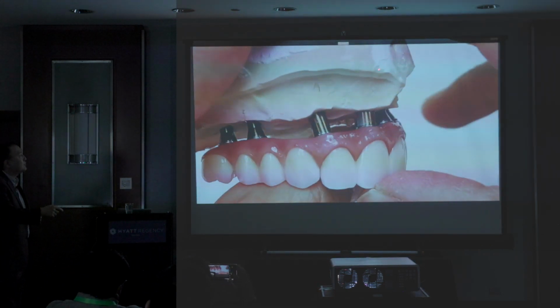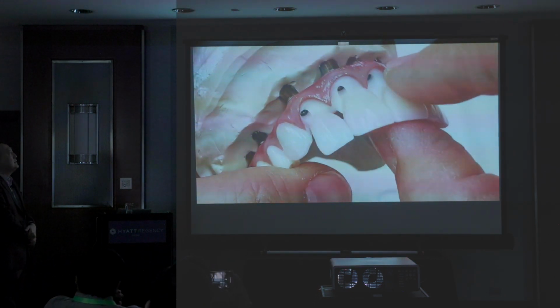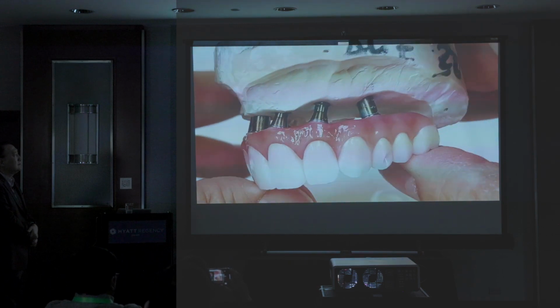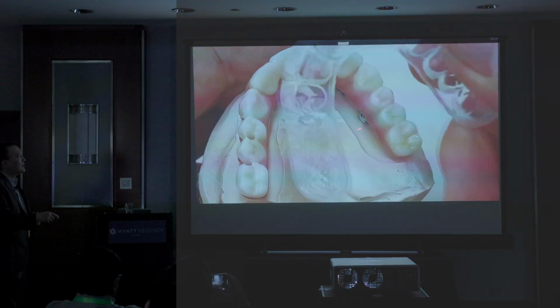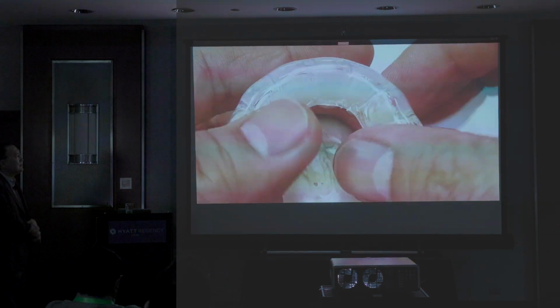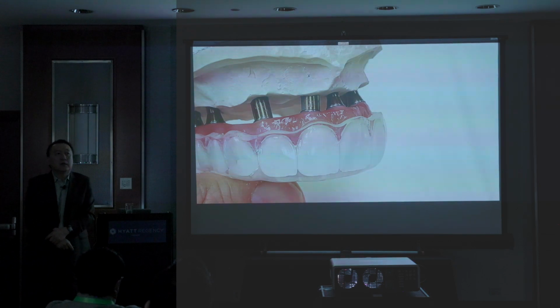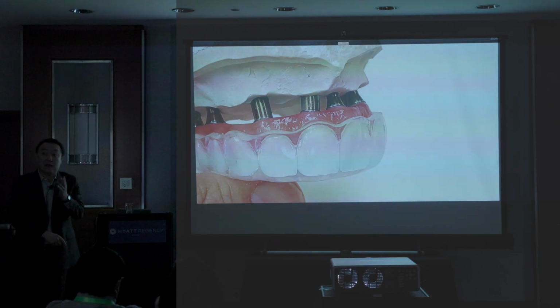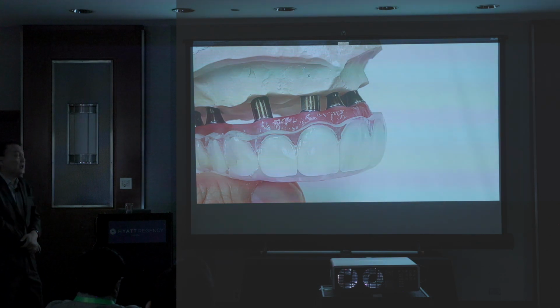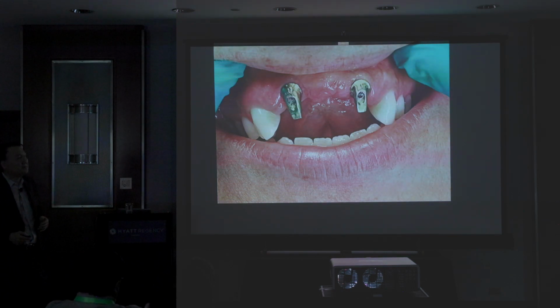So our job is to make better tissue contour in between the teeth. And then here the doctor can put the composite, and then we always give them a good soft night guard. I tell them all the time you have to wear it, especially at nighttime. You have to wear it. Otherwise, sometimes they drop it, or sometimes they're fighting, or sometimes the beer or whatever, they're cracking.